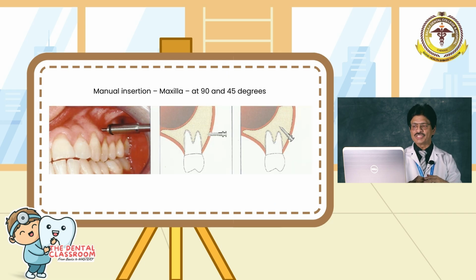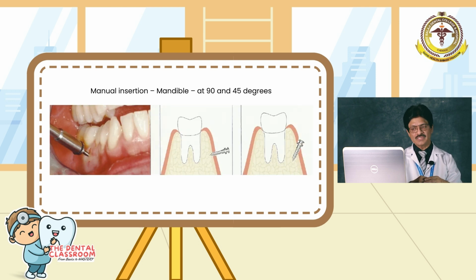So the manual insertion in the maxilla is either 90 degrees, as you can see on the left side, or on the right side, if you see that particular figure, it could be in a diagonal direction. And in the mandible too, it's the same. Either it is at 90 degrees or at 45 degrees.